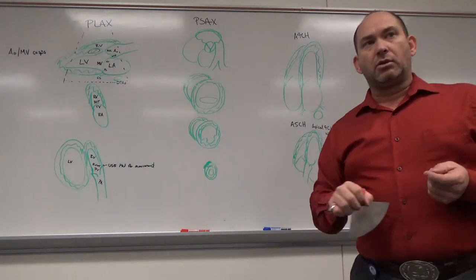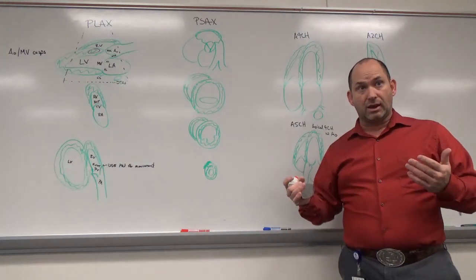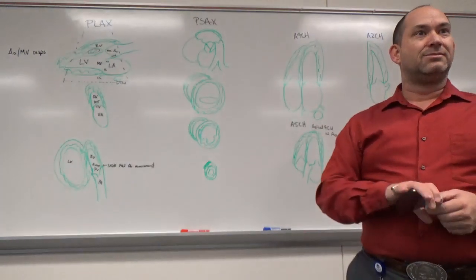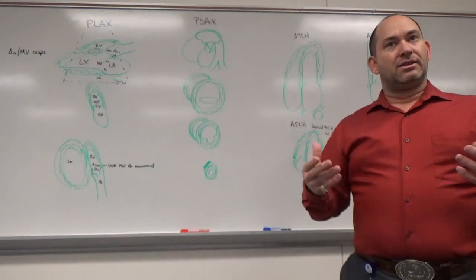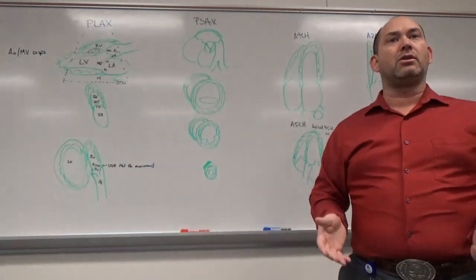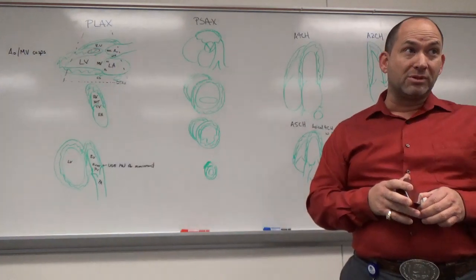So instructing your patient is really important. You'll notice that I tend to tell them to breathe in and then breathe out. The reason for that is, and this is just from my experience, as I'm scanning, so everybody right now just breathe out and hold it. Breathe when you have to. Okay, is it hard or easy just to, on the command, breathe out and hold your breath? Is that easy to do? Okay, now take a breath and go, and then blow it out and then hold it. Is that more comfortable? Yes.